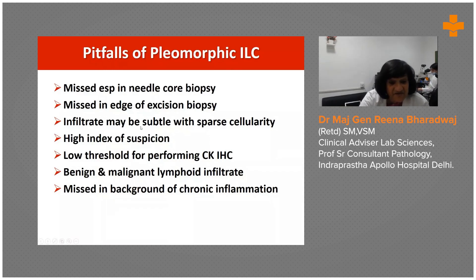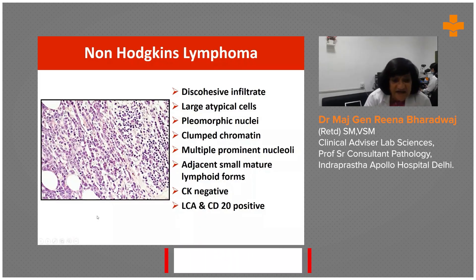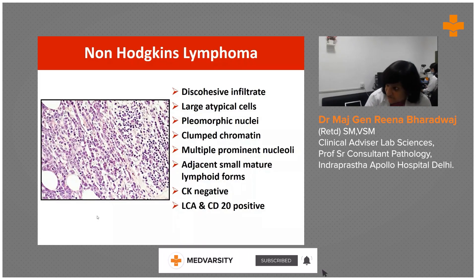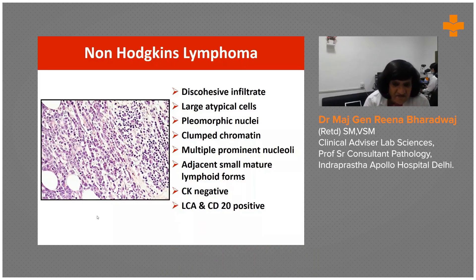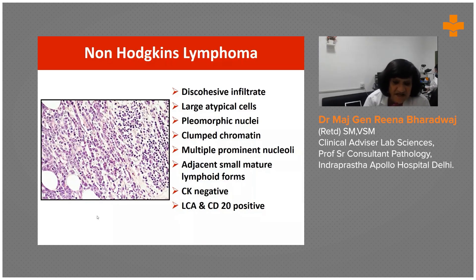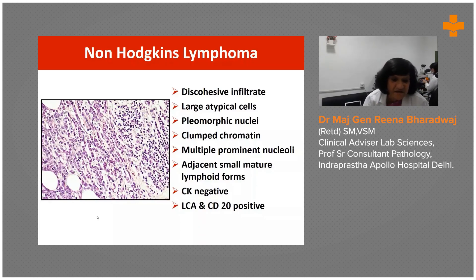The infiltrate may be very subtle with sparse cellularity. Maintain a high index of suspicion and perform immunohistochemistry if in doubt. An important differential is non-Hodgkin's lymphoma, which is also discohesive and shows large atypical cells with pleomorphic nuclei, clump chromatin, and prominent nucleoli. However, lymphoma will be CD20 and LCA positive and CK negative, and its incidence is much lower than lobular carcinoma.